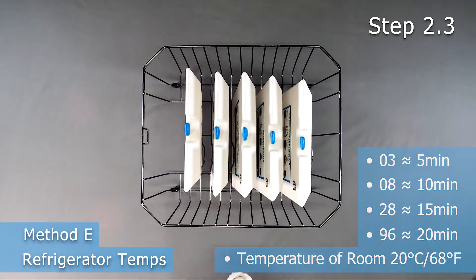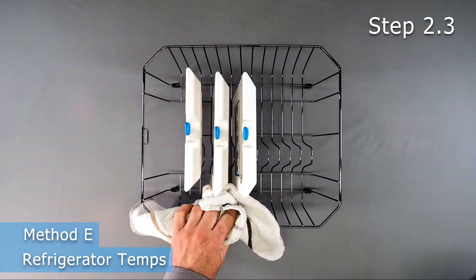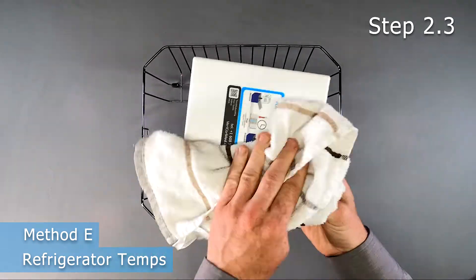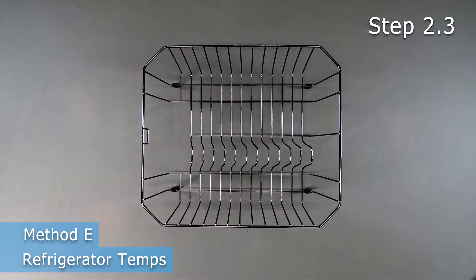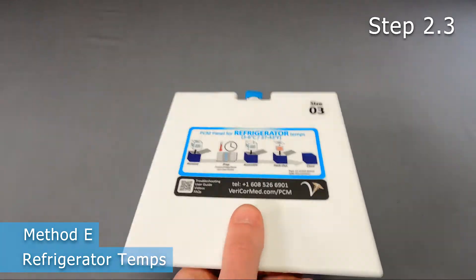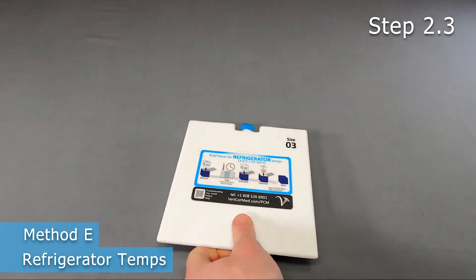After frost turns to condensate, the panel is above 0 degrees Celsius. Wipe off the condensate that may have accumulated on the panels and shake to verify that the PCM is completely solid. If liquid is heard, refreeze and proceed. Using liquid PCM decreases the hold time considerably.